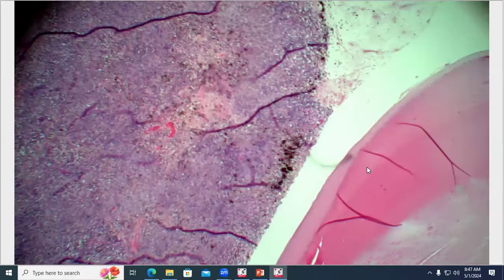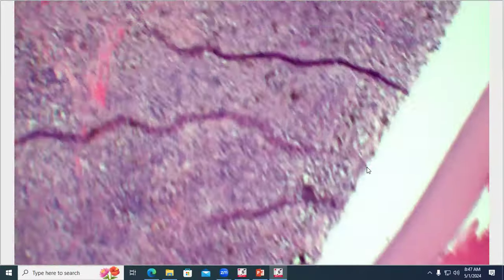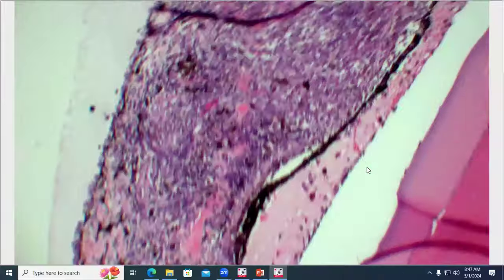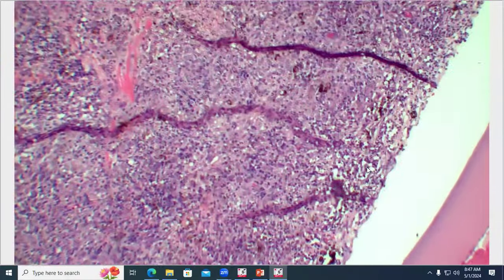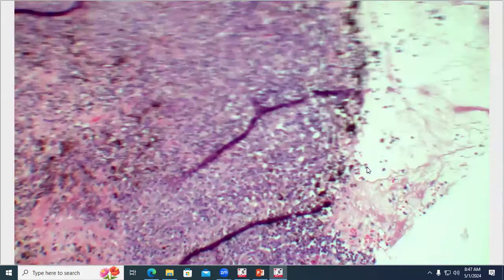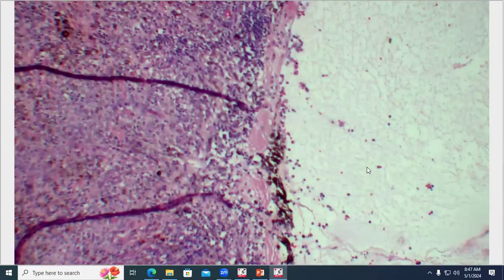Another interesting thing, if you look around and still talking about the melanin, the iris pigmented epithelium, you can see some of the normal iris pigmented epithelium right there. And if you keep moving, it disappears. Right, and it is associated with areas like that where there's scattering of that pigment and more melanomacrophages or melanin-laden macrophages. There's also exudation of fibrin in the chambers. It picks up again, but then it goes in and out.